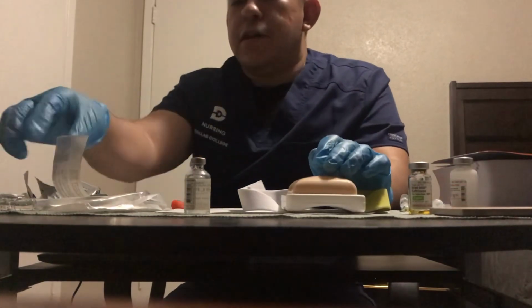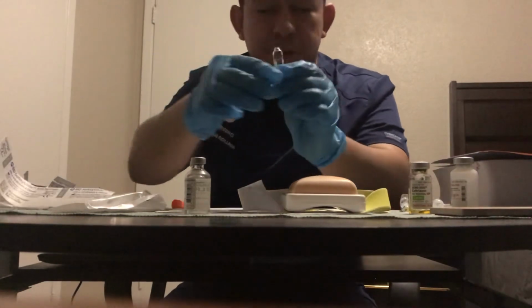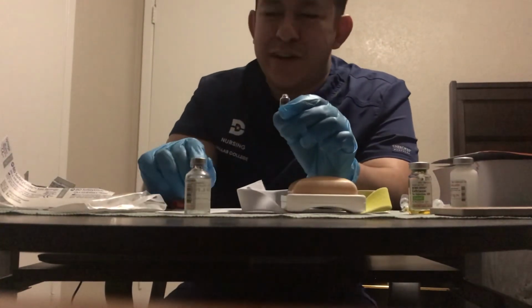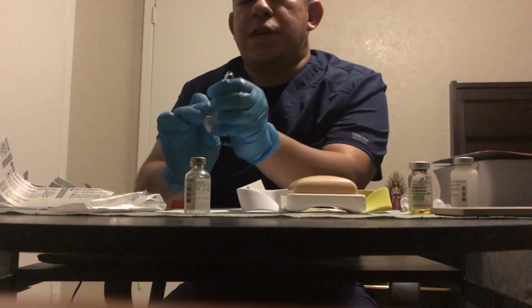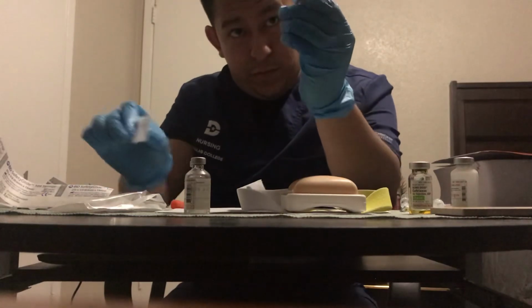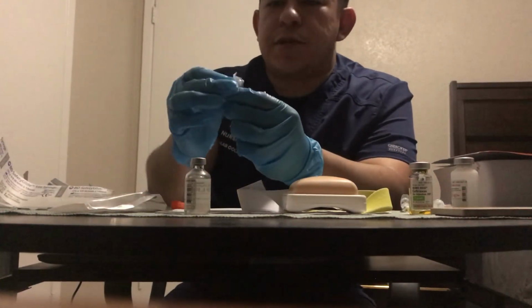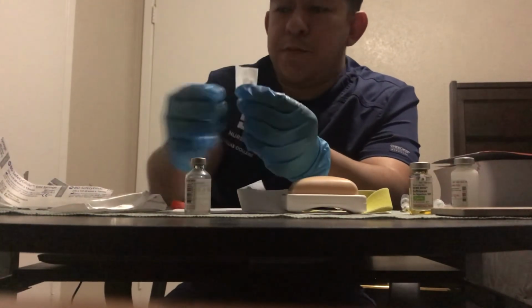And lastly, for an ampule, unfortunately I've already broken this one. It's the only one I have though. But when you open an ampule, what you want to do is make sure you have enough fluid, and you would simply grab an alcohol wipe, clean the ampule, and then grab the tip.